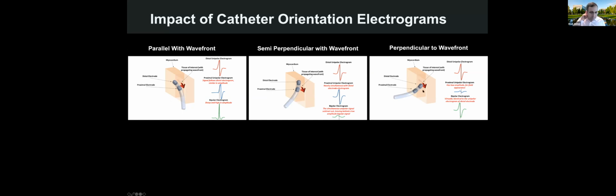And I think many times that's the difference in what we call high resolution with PentaRay. After we published these papers, I kind of wonder why it's not that simple. Why is it high resolution?